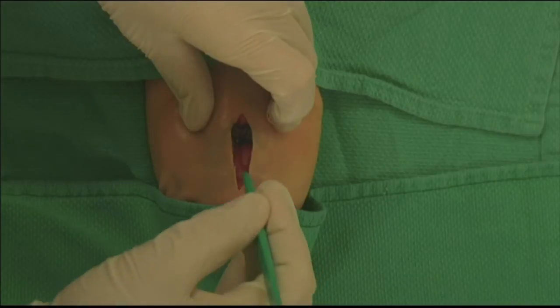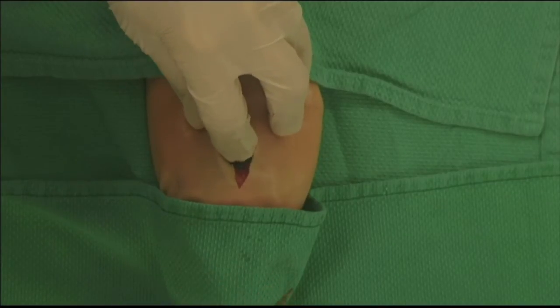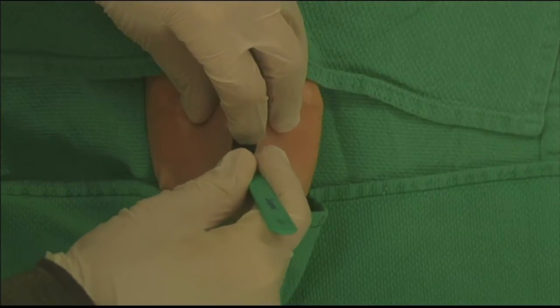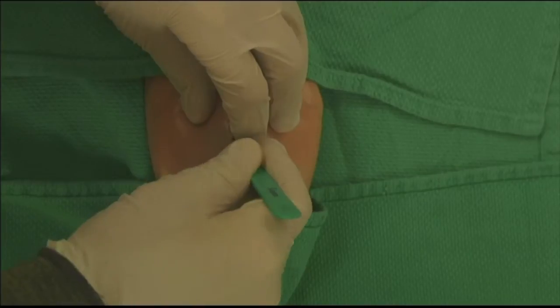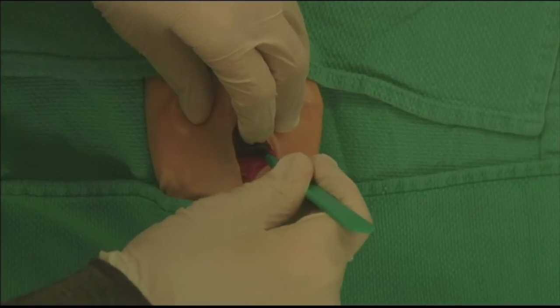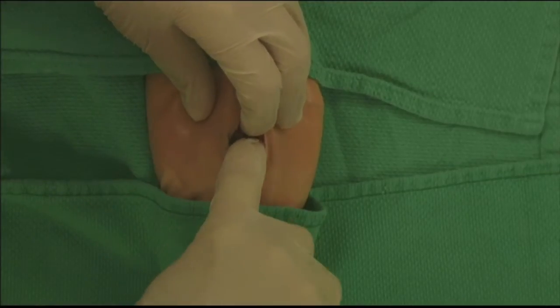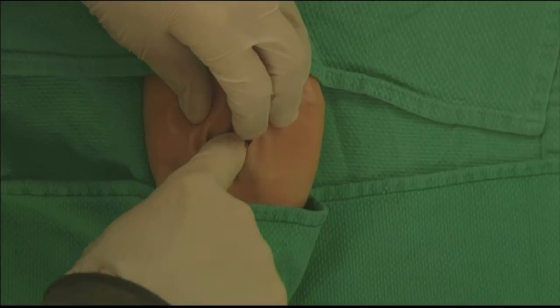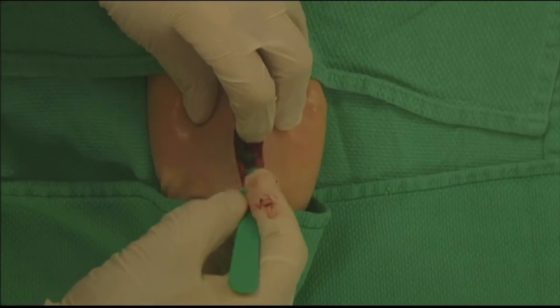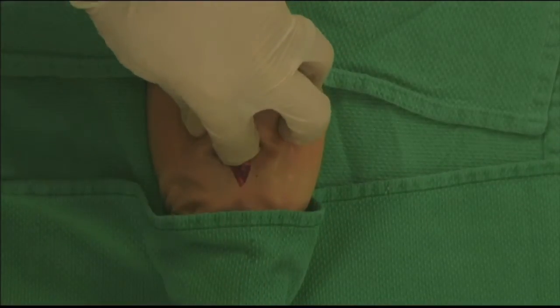Having identified midline, I'm going to stabilize the larynx with my first and third fingers on my left hand, and landmark with the second finger. I'll take my number 11 scalpel and make a generous vertical incision traversing the approximate location of the membrane — a blunt process to get landmarks more oriented. Then identify the membrane by palpation. The second incision is horizontal, a stab incision through the cricothyroid membrane. You feel good resistance when you encounter the posterior cricoid rings, cutting right then left, feeling holdup on either end from cartilage. There's quite a bit of tissue here.